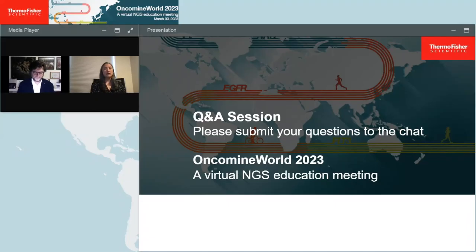The main difference between the two platforms would be the overall workflow and the turnaround time. With the GeneStudio, you have either manual or semi-automated library prep in a workflow with around a 3 to 5 day turnaround time. But on the Genexus platform, everything is fully automated with next day results. But you should get very highly concordant results whether you use either the GeneStudio or Genexus platform.